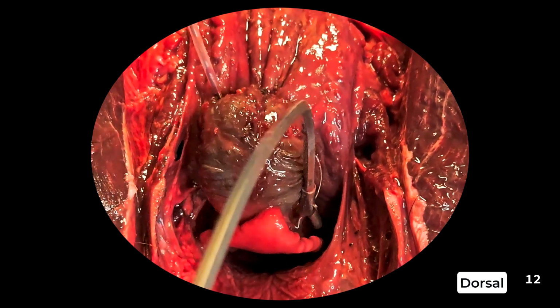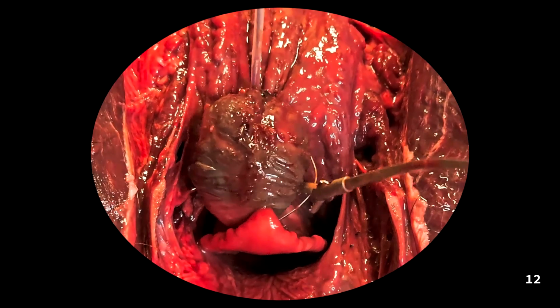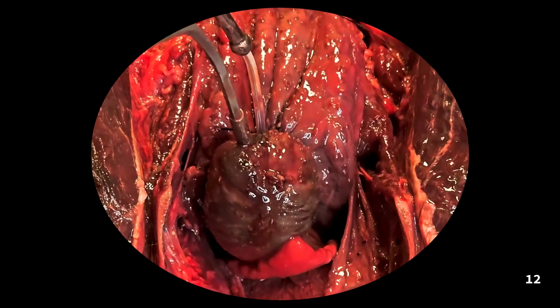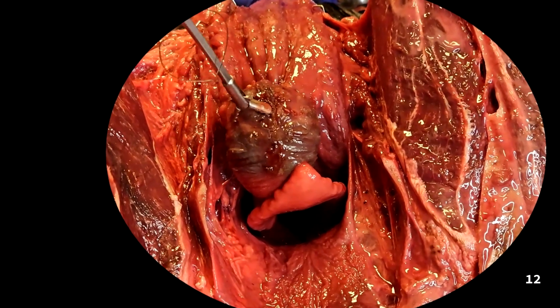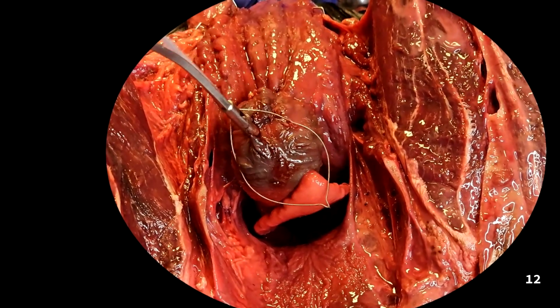The cautery is then activated to remove the cyst. Big cysts can be drained before the removal using a sclerotherapy needle. The cyst lining is then pulled out through the mouth, and the surgery site is left open to heal via second intention.